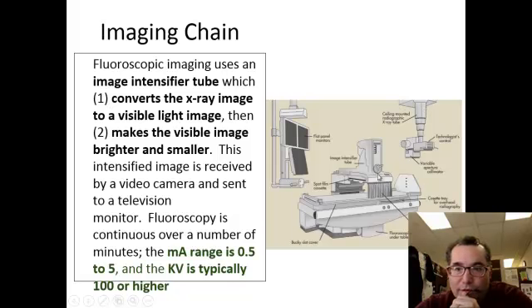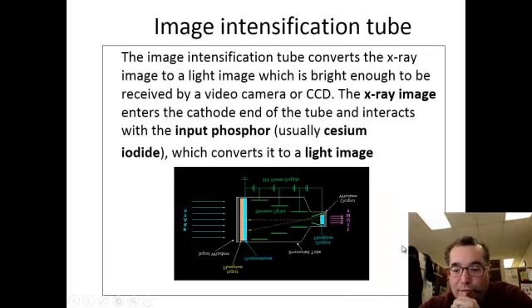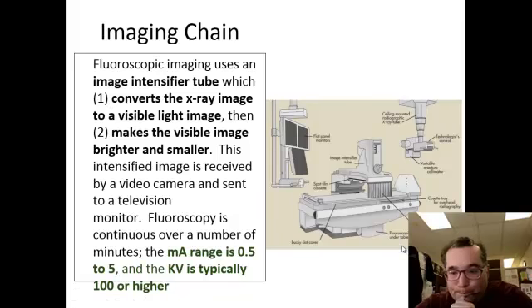But you can see here there is a fluoroscopic carriage. There's a handle here so that a radiologist can move this up and down the patient. And down here, what you have is your actual fluoroscopic x-ray tube under the table. So this image intensifier that I keep talking about that kind of looks like a cylinder is housed inside of this unit. Doesn't look very cylindrical here because this is the outside housing.